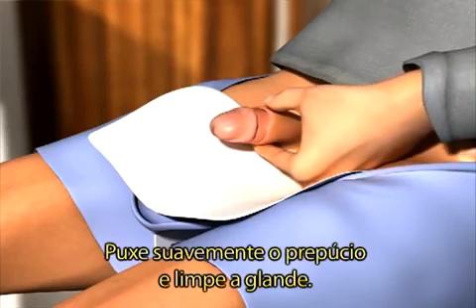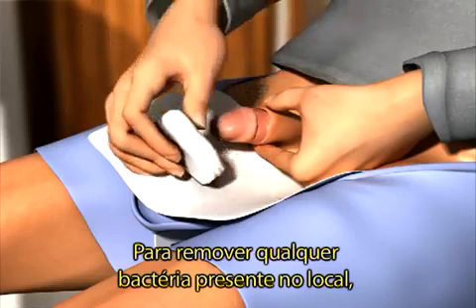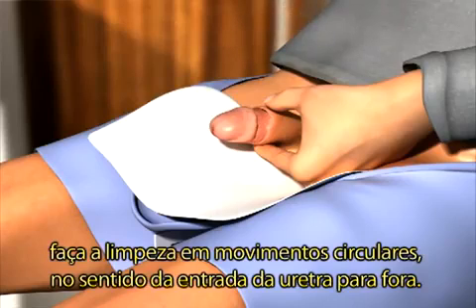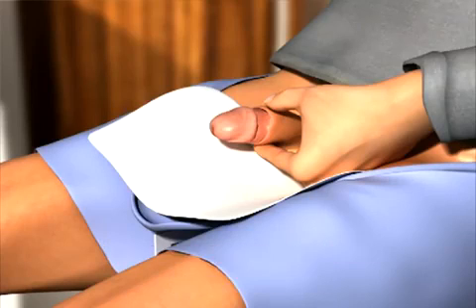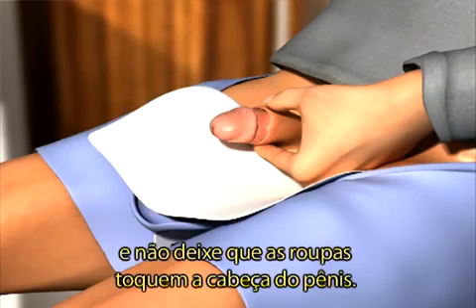Gently pull the foreskin back and wash the head of the penis. To remove any bacteria that might be present at the opening of the urethra, you should wash in a circular motion, starting at the urethra and working outward. Use each cotton wool pad only once. From this point, make sure that you keep holding the foreskin back and that you do not touch the head of your penis with your clothes.